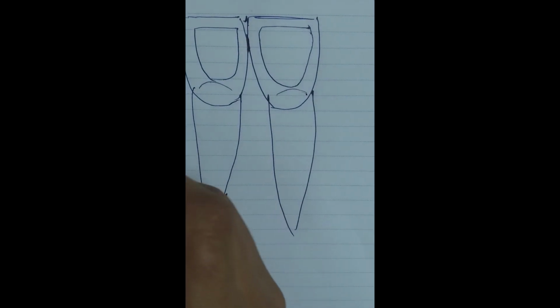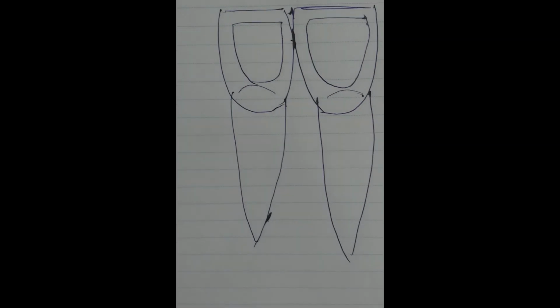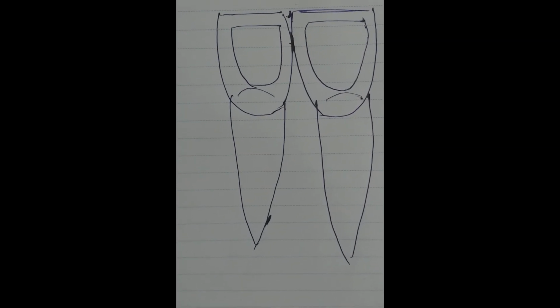This is the incisal wall of our preparation.